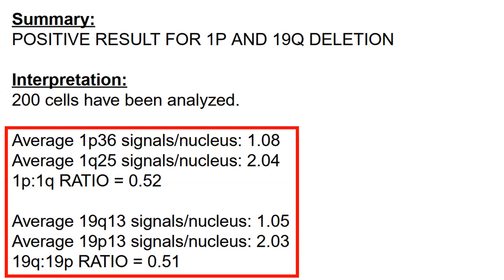Maybe the tumor was very pleomorphic, and you're not expecting oligo, and all of a sudden the FISH report comes back and it says positive for co-deletion. Look at the data. Maybe it was a bad call. Maybe it's really close to the cutoffs. Maybe those ratios vary. Everyone got that? Okay.